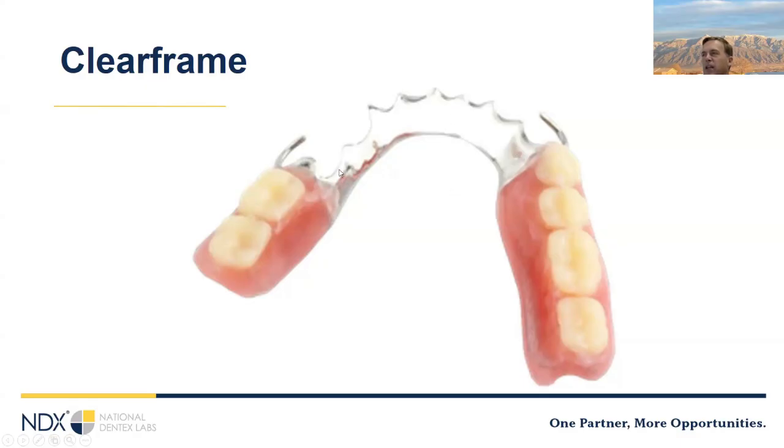The main thing is this is a nylon material as well, so it cannot be repaired. So this is traditional teeth, traditional acrylic, so you can reline it, you can replace teeth, but you can't repair the frame.